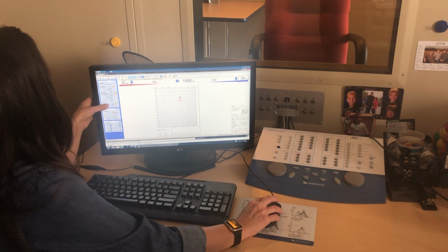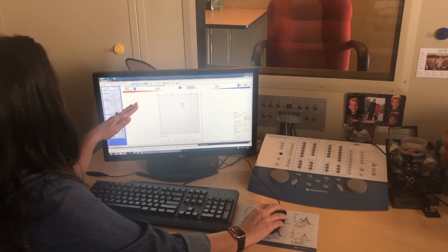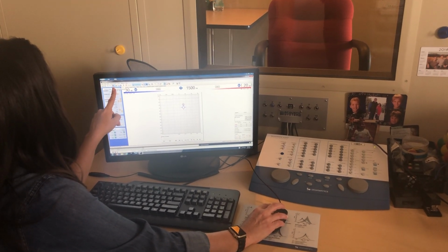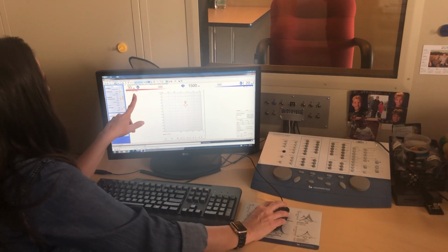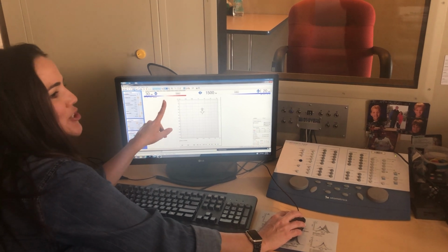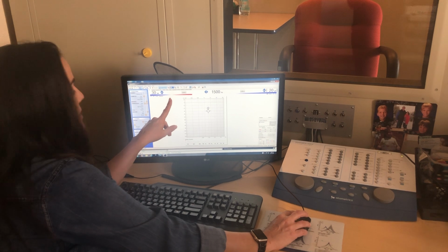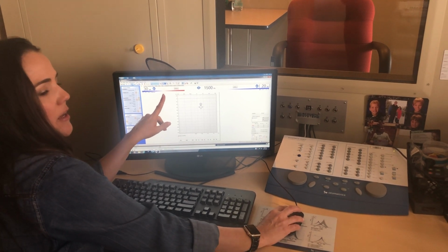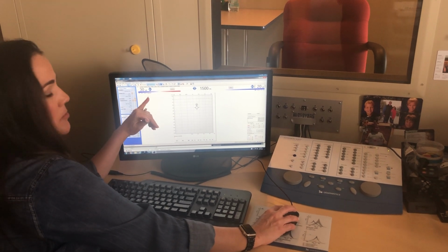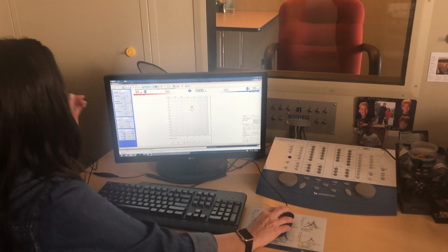And then you can choose left or right on which ear you're gonna test, or you can also come up here where the ear is, and you can toggle back and forth between left and right. Now, one thing to be cautious about, if you'll notice I'm on right ear now, when I click it again, this is actually binaural. You don't wanna test binaural, you wanna test ear specific. There are some tests that I do for APD that involve presentation of sound to both ears simultaneously, and that's what I would do. But for the purposes of this class, you're gonna just do right and left.